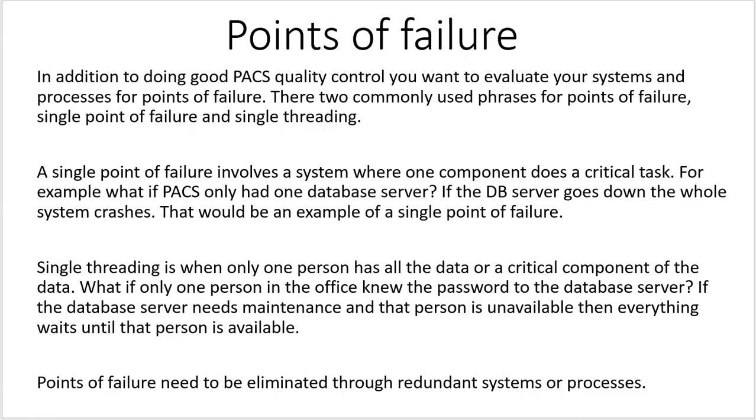Single threading is when only one person has all the data or a critical component of the data. What if only one person in the office knew the password to the database server? If the database server needs maintenance and that person is unavailable, then everything waits until that person is available. Points of failure need to be eliminated through redundant systems or processes.